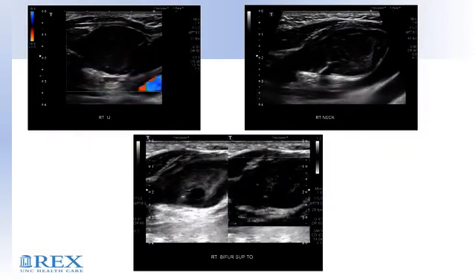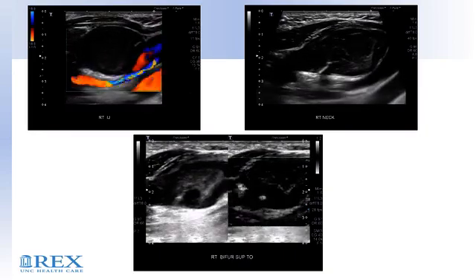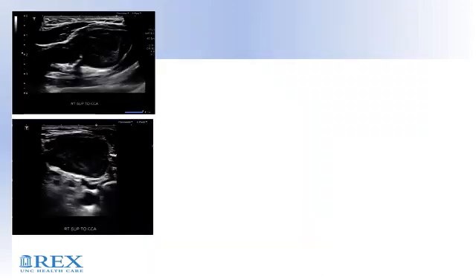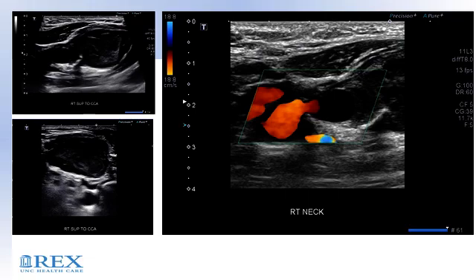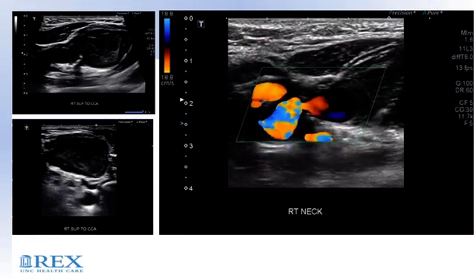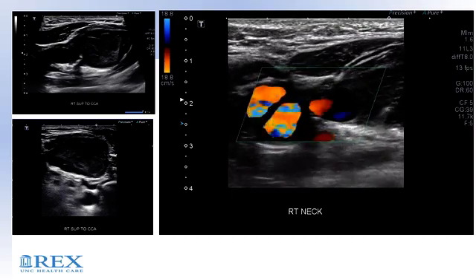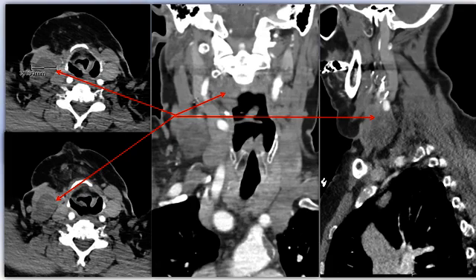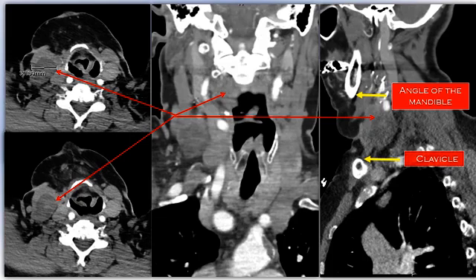Here's a look at SMI. You always want to look at pathology from two dimensions — the sagittal depiction on top and the transverse depiction inferior. Color Doppler is very important — you can see the neck of the pseudoaneurysm. The Doppler pattern is not like a traditional pseudoaneurysm with a to-and-fro component in the groin; this has an obliterative type of pattern, like you're coming up on infection and occlusion. The person was sent for a CTA. This is a problem: this person's false aneurysm extends up to the level of the angle of the mandible. The person had a short, fat neck, and the aneurysm extended down to the end of the clavicle. They may have to disarticulate the jaw, and are calling in secondary specialists from UNC.